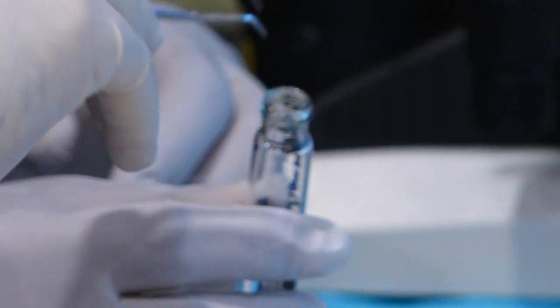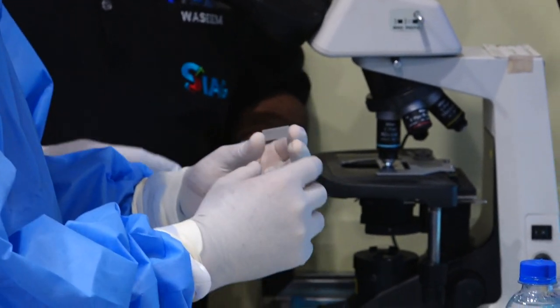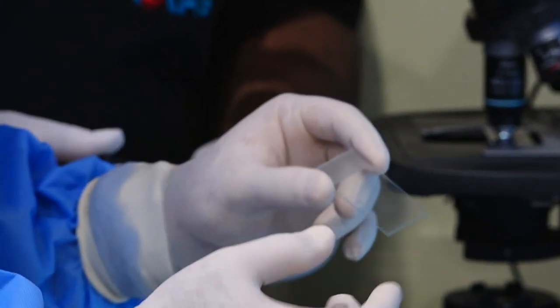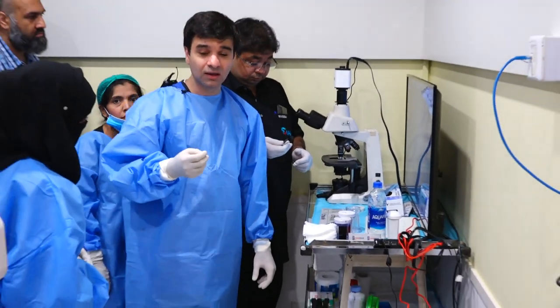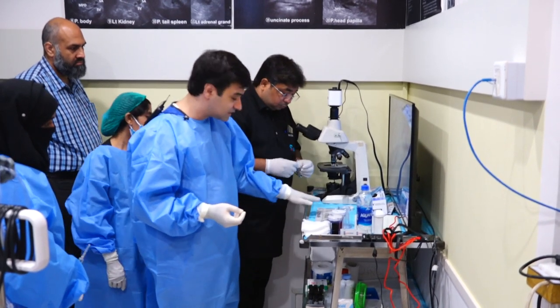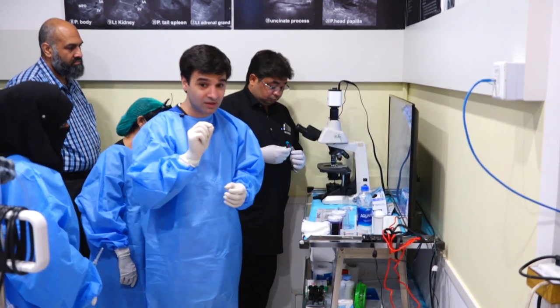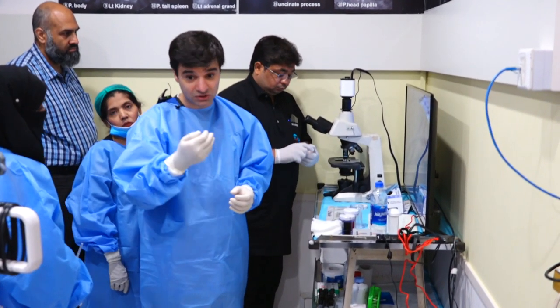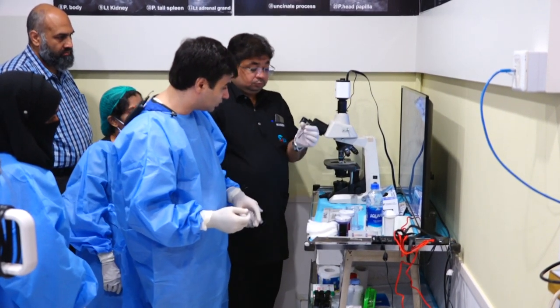Now what we've created is a slide that has what we call touch imprint. Our unit published a paper on the importance of touch imprint cytology that Dr. Hassan headed, to see whether it determines the type of resection that you're going to do. In this case, it is helpful because you're saving the core of your tissue, and at the same time, you have enough cells there to get an adequate histological evaluation. So we're now going to do a quick diff that Waseem will do.